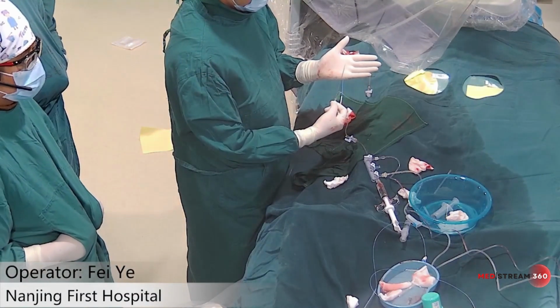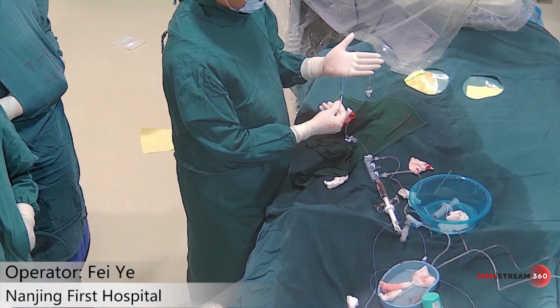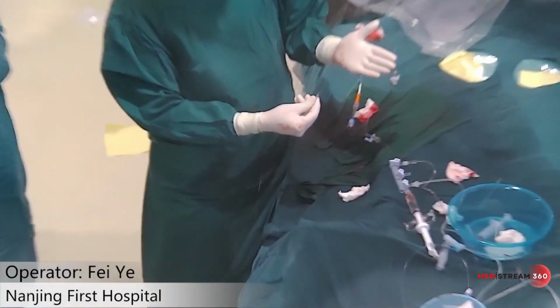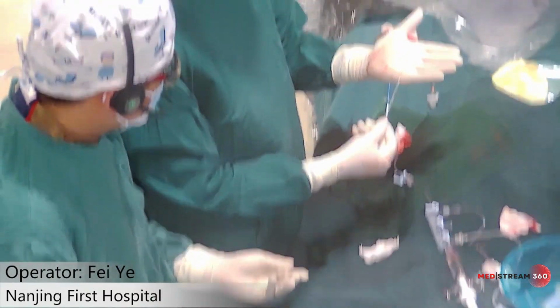Yeah, it's not very clear. Zoom in more. No. You torque the wire, Dr. Chen Liang, please. Torque, rotate. Yes.